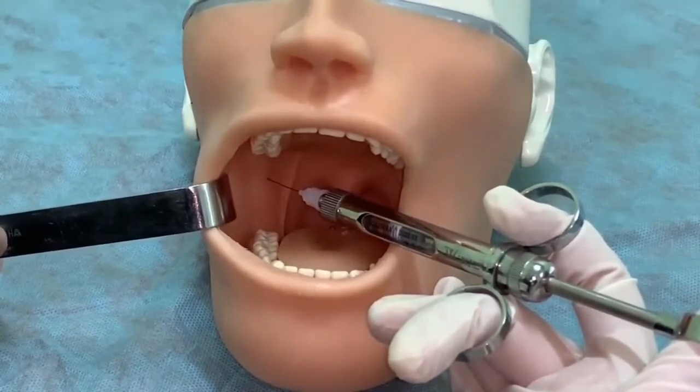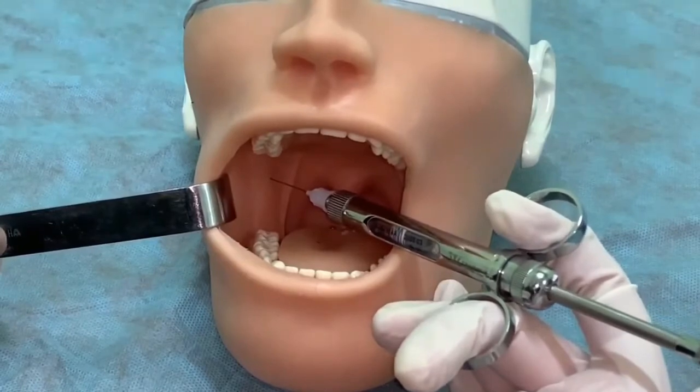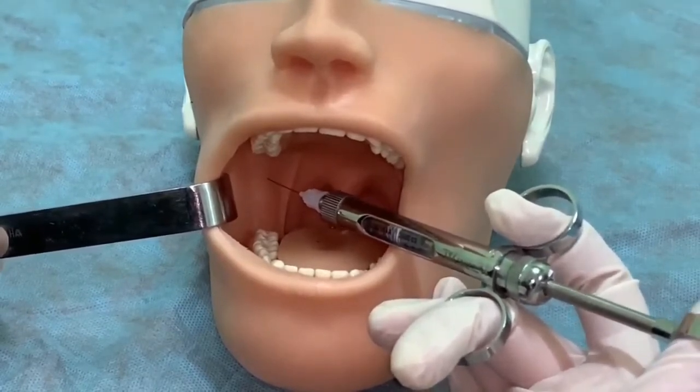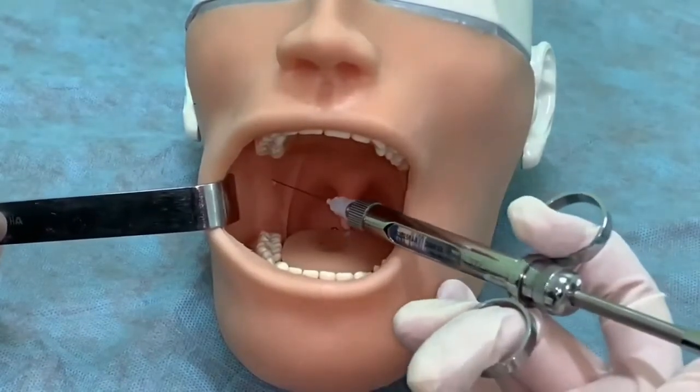Ask the patient to open their mouth wide. Determine the location of the target point. Treat the injection site with antiseptic. Carry out application anastasia.